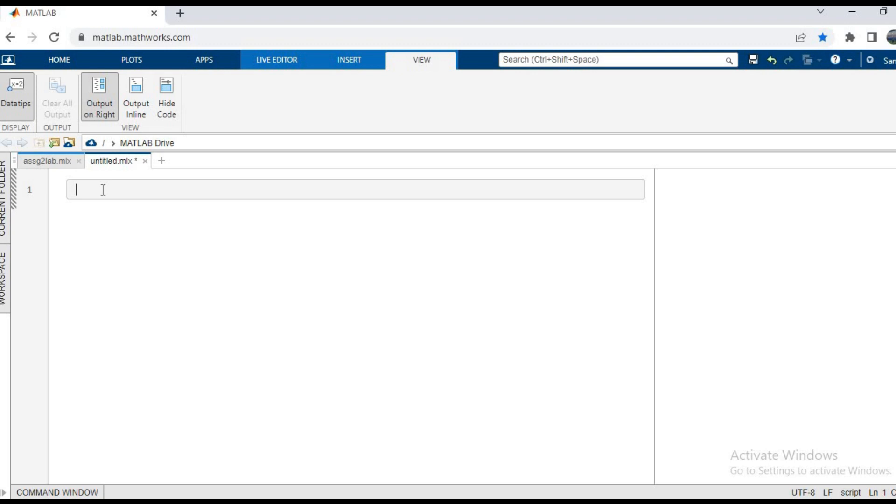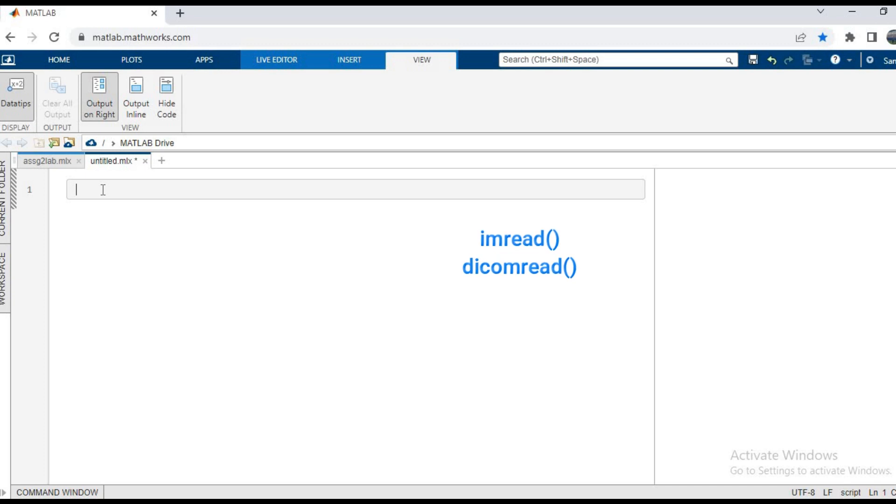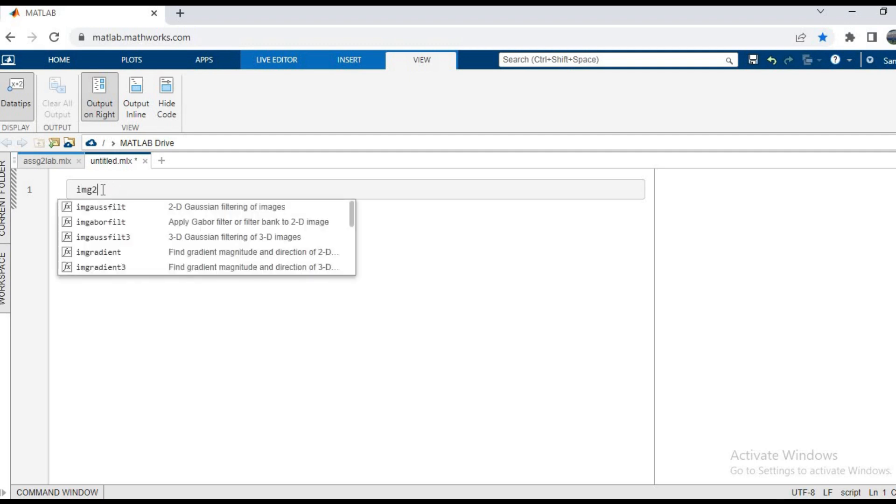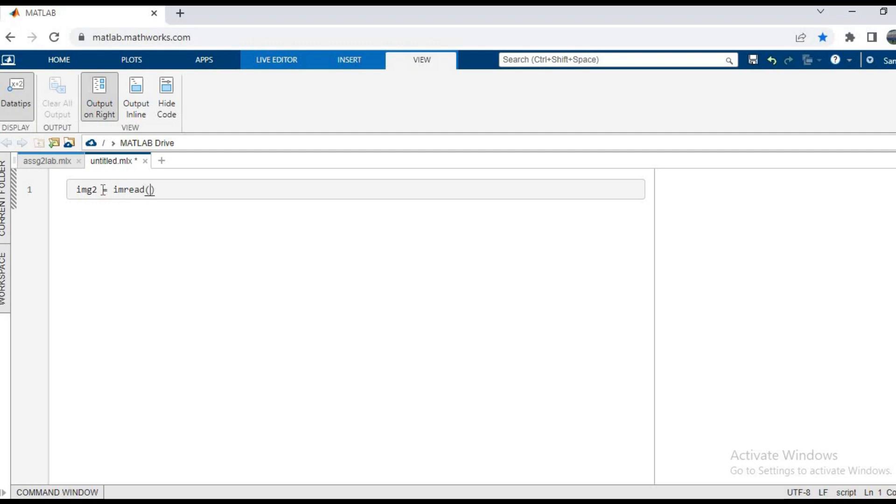In this one, we are going to use imread to see if it works or not. So I'll write img2 equals imread and name the file which is in my folder, that is q2.dcm. The autosuggest suggests it, and here we go.